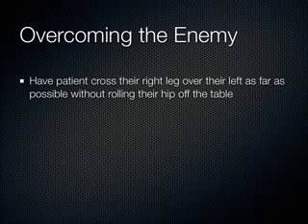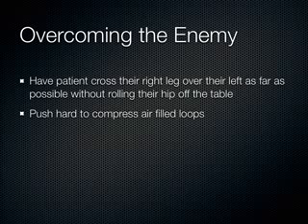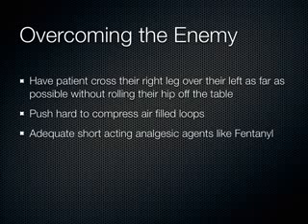On my earlier demonstration, I forgot to do that, but I think it's important to put the right leg over the left leg as far as possible without the patient falling off the table. And then you're going to push really hard. You're going to push harder in the abdomen than you've ever pushed before with an ultrasound transducer today. But don't worry, the models are getting paid to tolerate that. They'll push you away if it hurts too much.